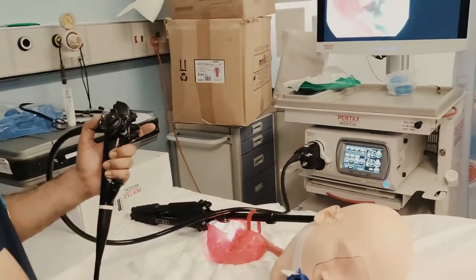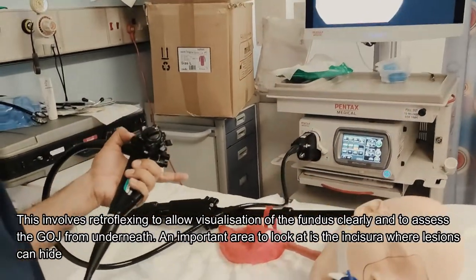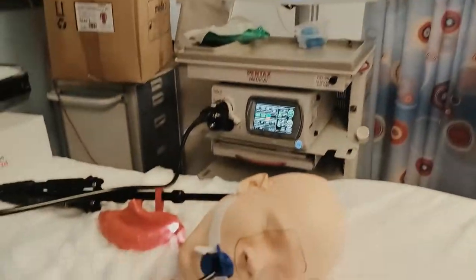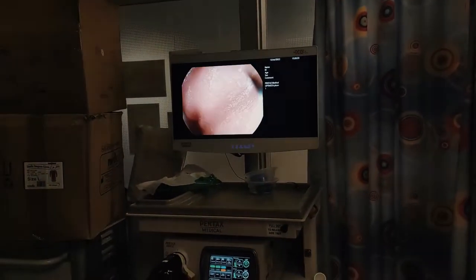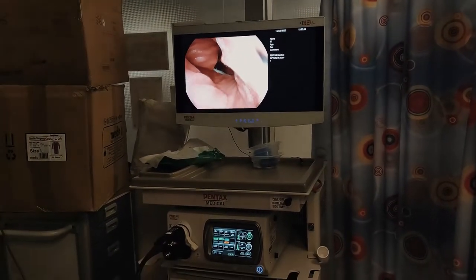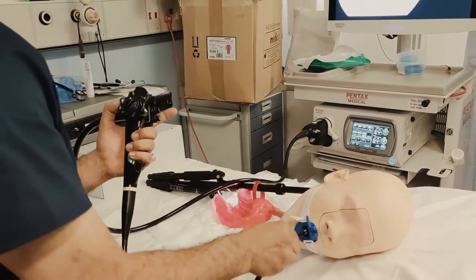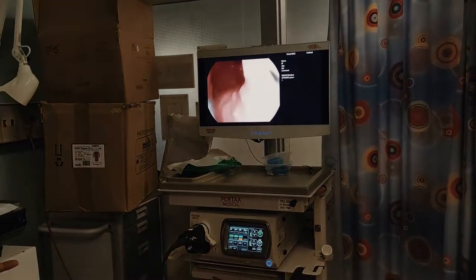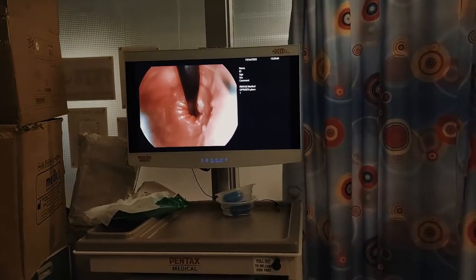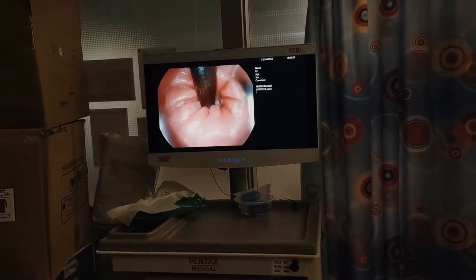Dr. Havari will now show us what a J manoeuvre is. The J manoeuvre is the way that we look at the fundus. He pulled back fully on the wheel to look back on itself, and then he's pushing down on the scope — if he keeps doing that, the scope will be visible on itself. He's pulling back on the wheel, pushing forward, and if you look, it's now turned back on itself. This is the J manoeuvre and it's very important for us to look at the fundus to make sure we haven't missed anything.